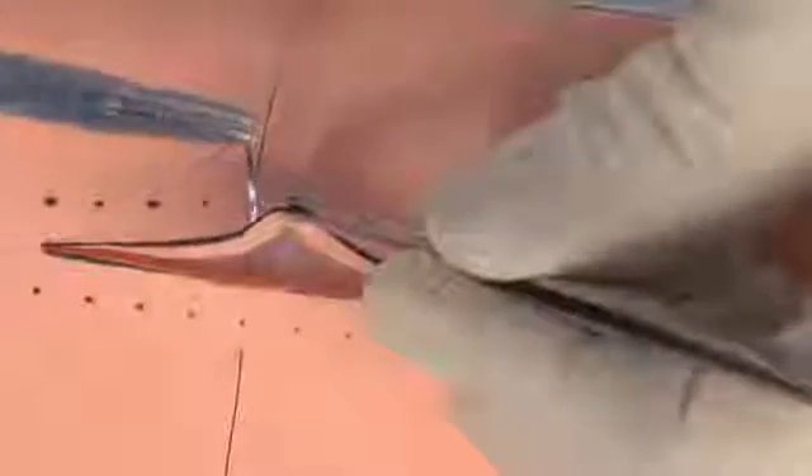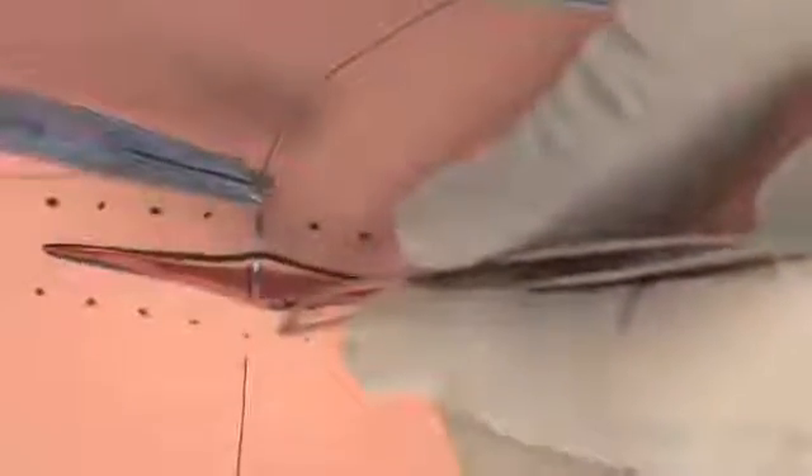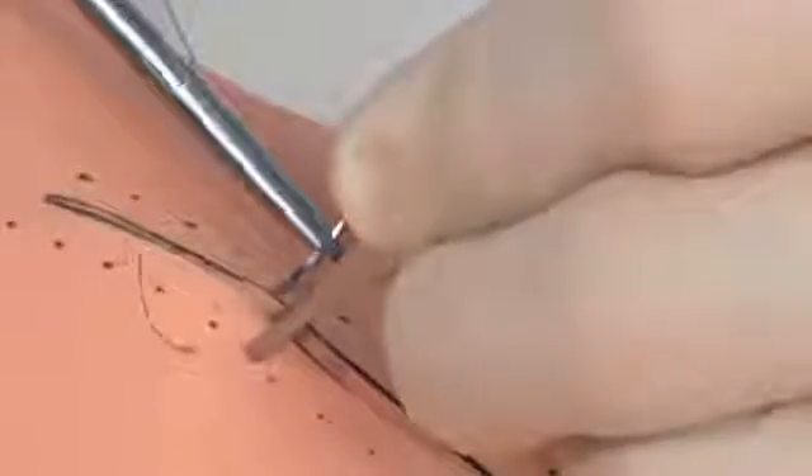Lift up the skin, enter, and come out about halfway down the skin thickness. Enter on the other side about halfway up the skin thickness and come out through the skin. Hold on to the skin with your Adson forceps while you pull the needle on through.